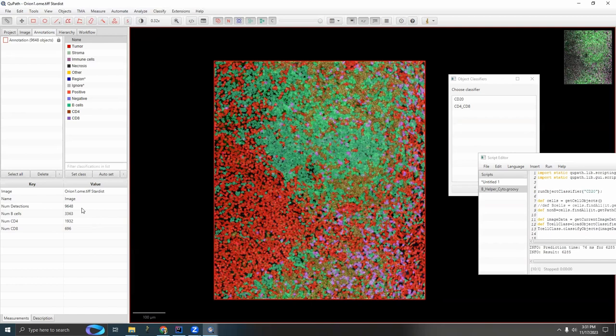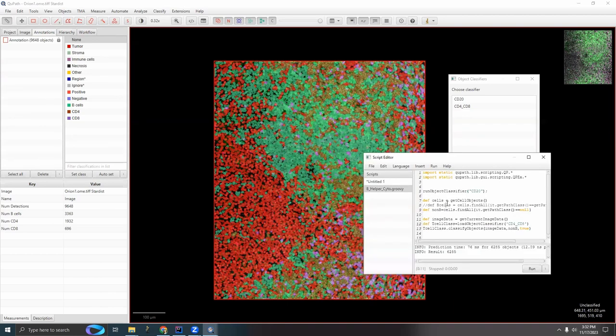So you only want to do this when you're absolutely certain of what you're looking at and you're already confident in your segmentation, in your classifiers, and you already know what your error rate really is. I'd also like to point out that it didn't in any way make a choice between whether those artifacts were either B cells or T cells. Because we applied the classifiers in a certain order, it just used that order. Anything that was CD20 is a B cell, period. It didn't make any further decisions. So you want to use a script like this carefully, but it can really help clean up your data at the end.